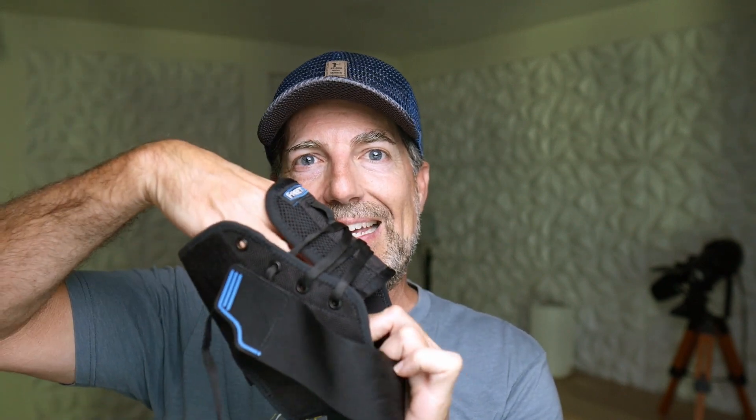I wear a size 9 shoe and I got the medium size — that was their recommendation based on their sizing chart. One thing I noticed is that in order to get my ankle all the way in, I really had to loosen it up. Typically, the laces come out of the top eyelet; just loosen it up to get your ankle in.